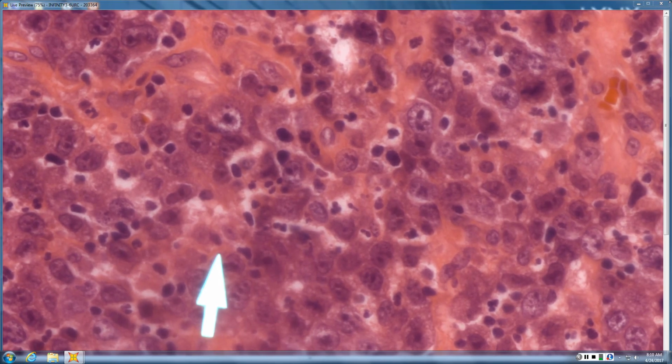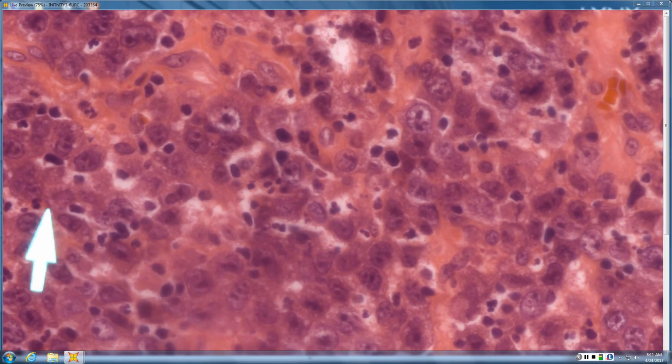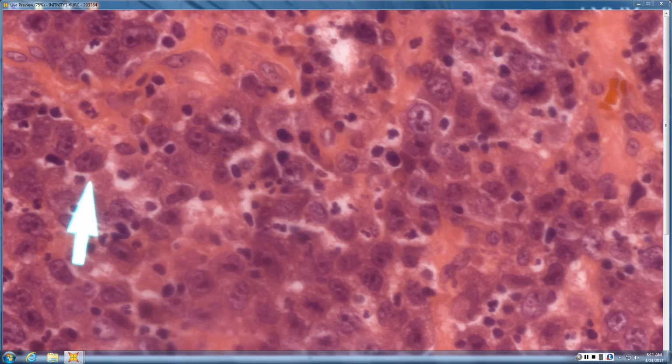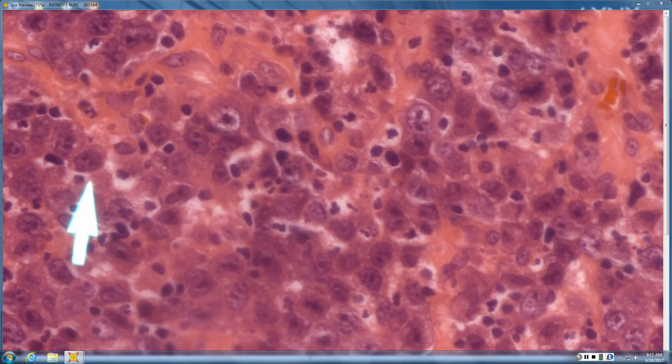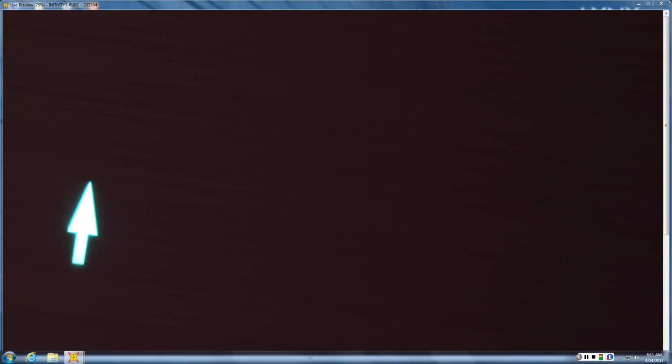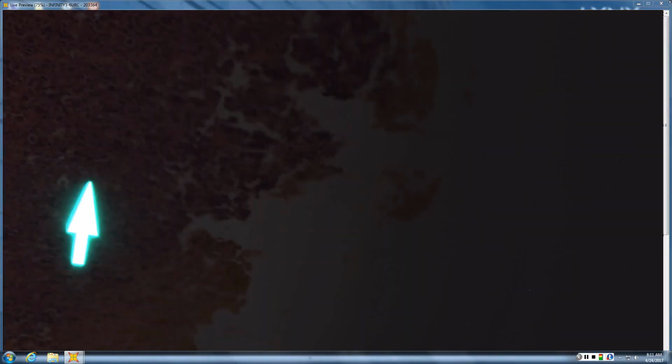So when you see these, they look different from a B cell. One of the differences is that they retain much more gray nucleoplasm throughout, and have prominent nucleoli. So that's a cell where you reach for your CD30, your Ki-1. And you have Ki-1 cells in sheets.